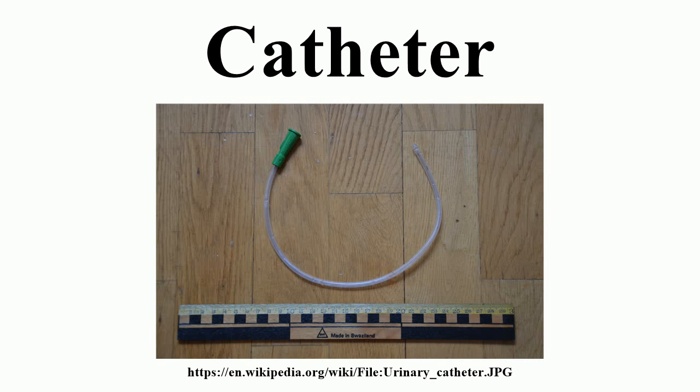In most uses, a catheter is a thin, flexible tube, though catheters are available in varying levels of stiffness depending on the application. A catheter left inside the body, either temporarily or permanently, may be referred to as an indwelling catheter. A permanently inserted catheter may be referred to as a perm-cath.